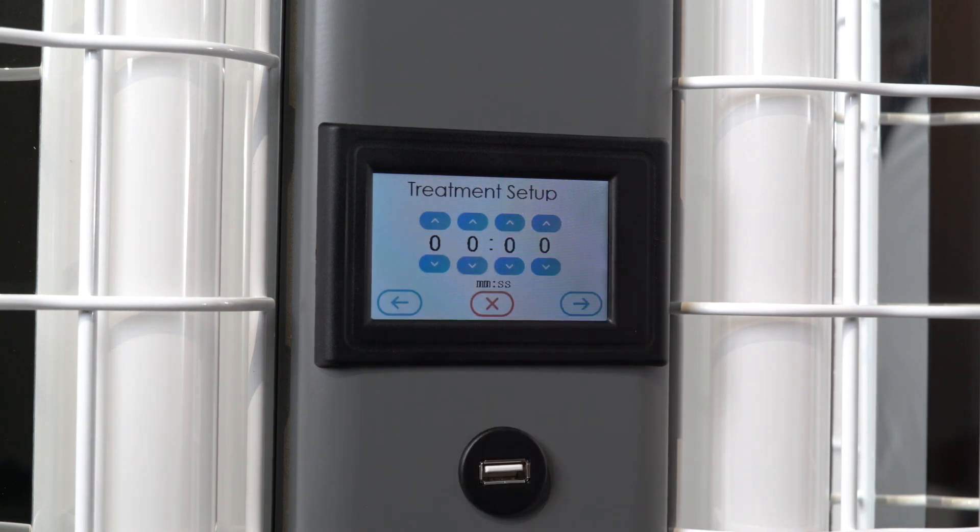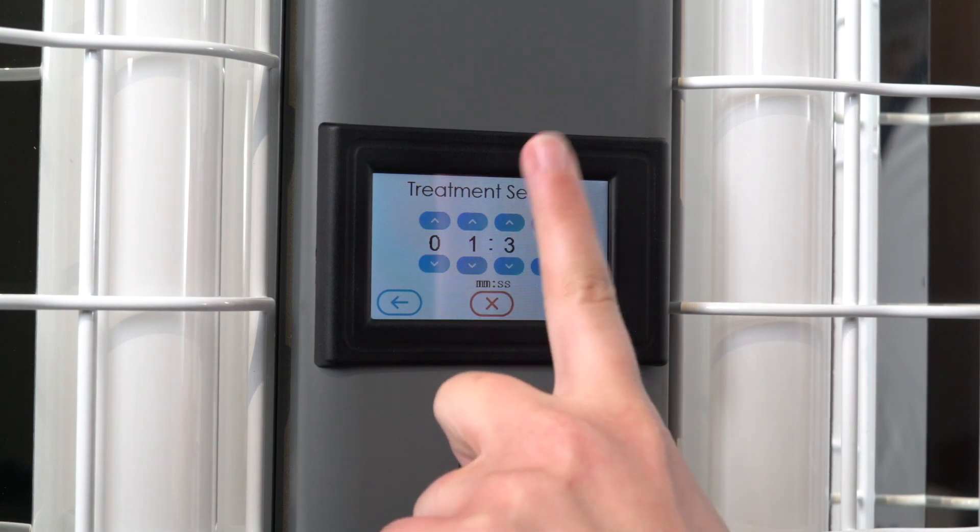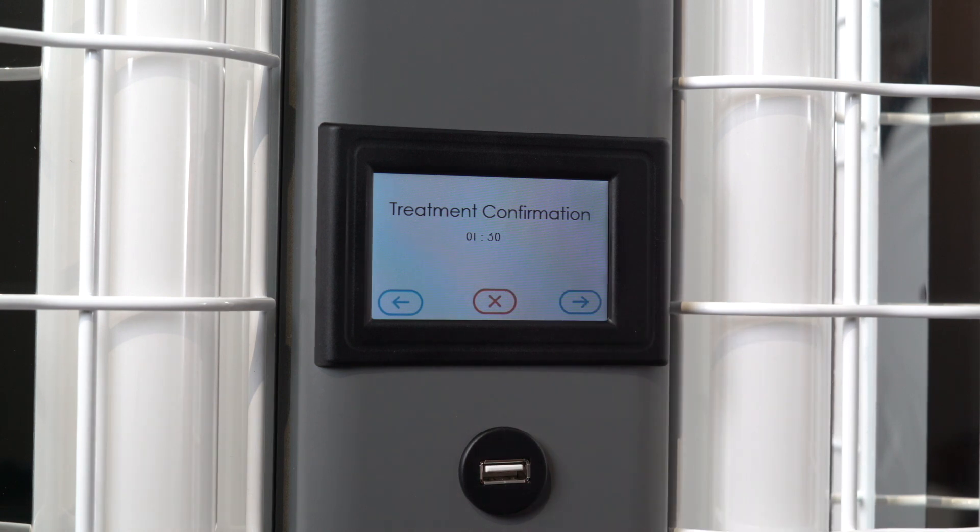Four up-and-down arrows will appear that correspond to minutes and seconds. Using the touchscreen, press the arrows until the desired treatment time is entered. If a treatment time is less than 10 minutes, the leading number must be zero. For this example, a treatment time of 1 minute and 30 seconds is used. Once you have successfully entered your treatment time, press the forward arrow key to continue.